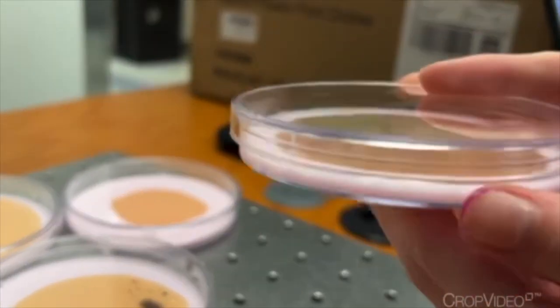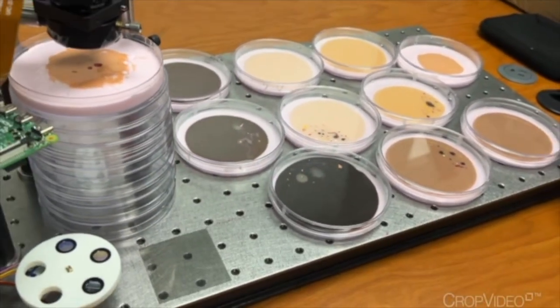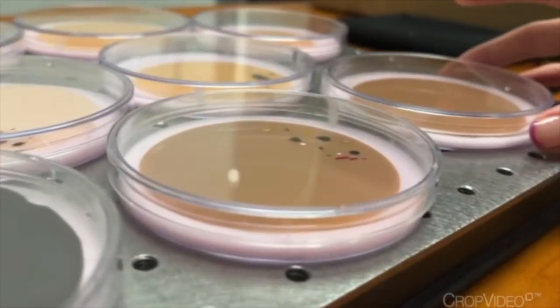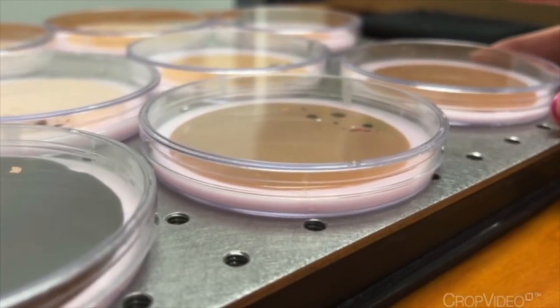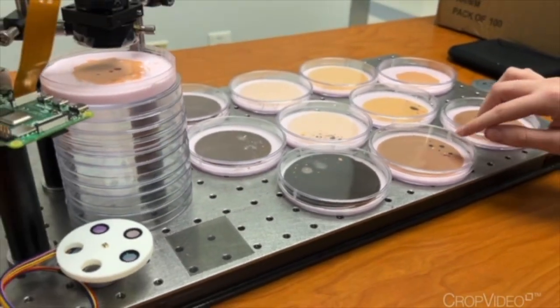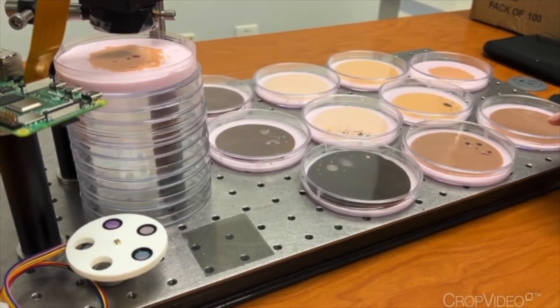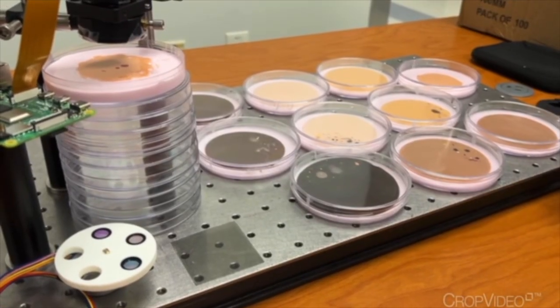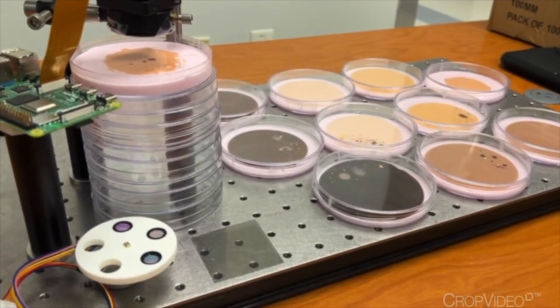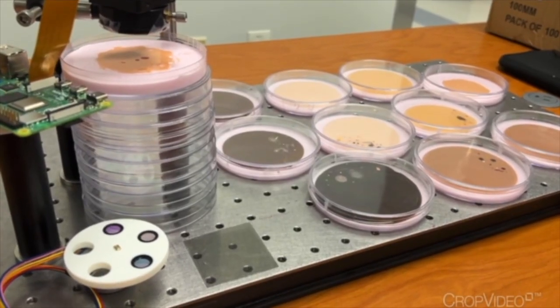So that would be, yeah, these are the two different layers. You can see a little bit more clearly the thicker, more translucent dermis layer on the bottom, which is the pink that you can see, is between 2 and 6 millimeters thick. Some samples also include small embedded channels designed to simulate subsurface blood vessels. This is important for optical imaging, so we can test the different wavelengths when it comes to this. For each skin tone, we casted samples at 1, 2, and 4 millimeters thick to prepare for reflectance and transmitted measurements using light-emitting diodes operating at 470, 530, 630, 850, and 940 nanometers.